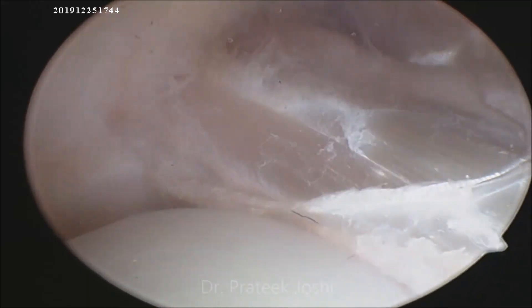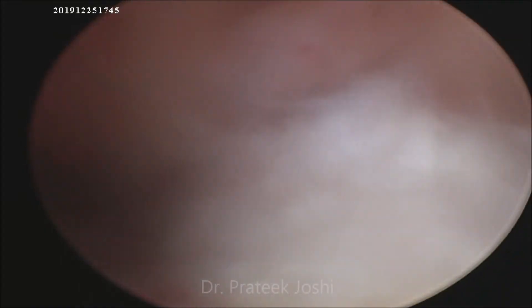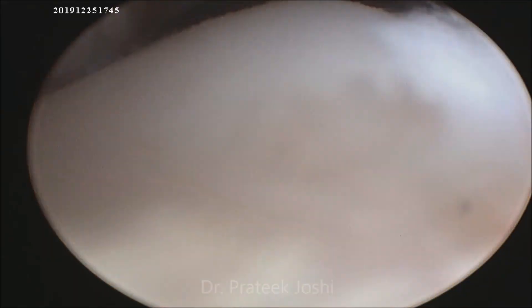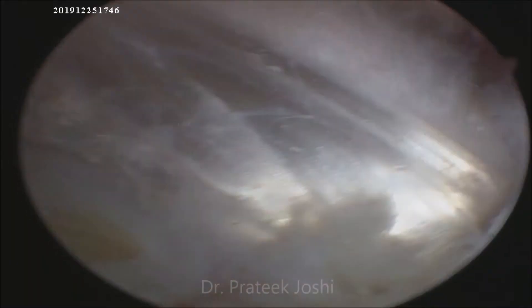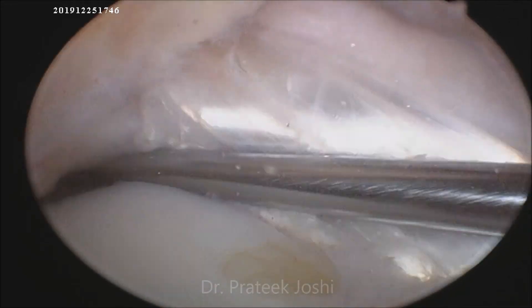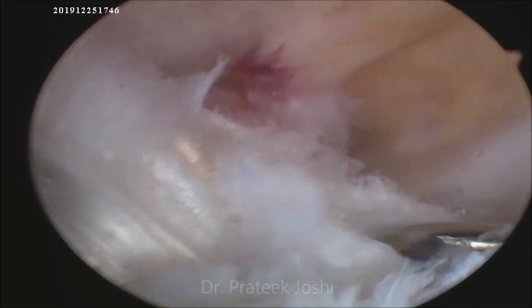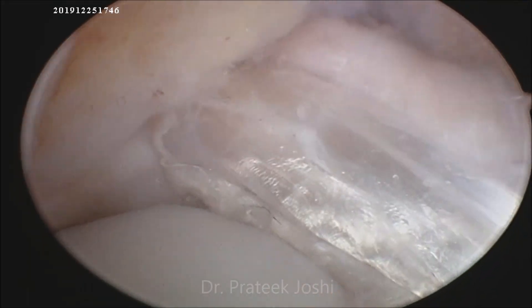This is the final picture of our graft with good tension and no impingement. Thank you.